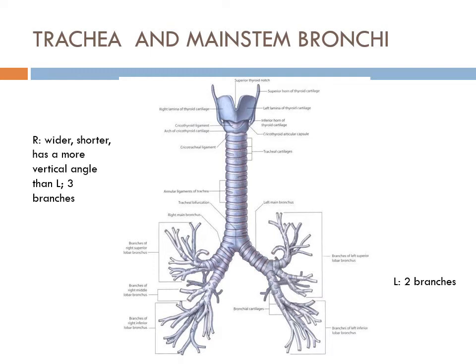It's very rare that we put right double lumen tubes in, unless we have to take the whole lung out on the left side, or if we had some type of cancer on the left main bronchus, where we can't put a double lumen tube in because it's probably right where they're going to cut out and re-stitch and all that. But almost always we're going to do a left double lumen tube, for a good reason. They're not easier to put in, but they're easier to maintain and safer.